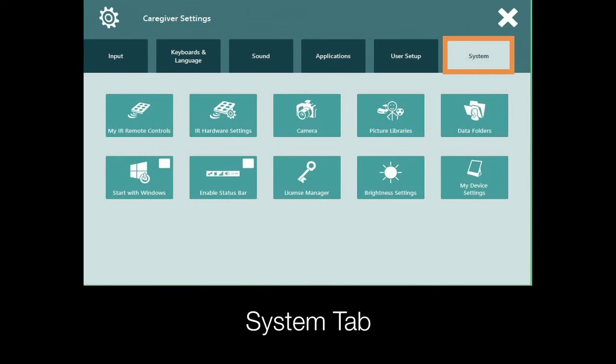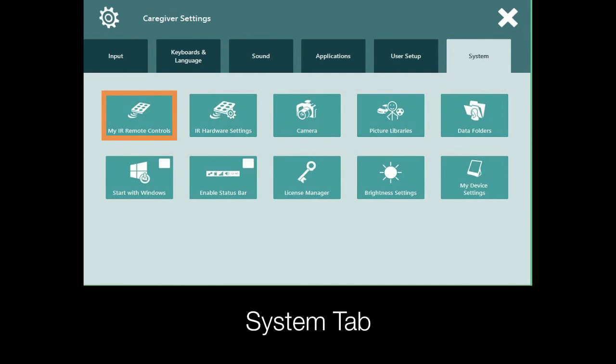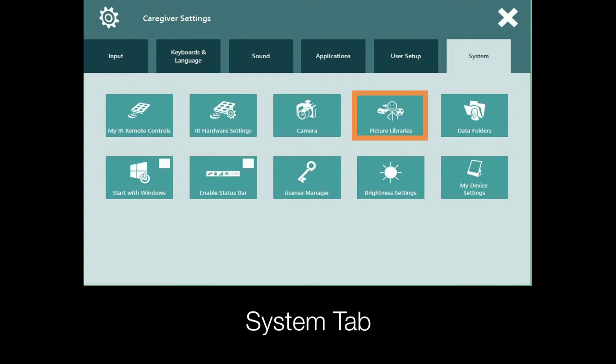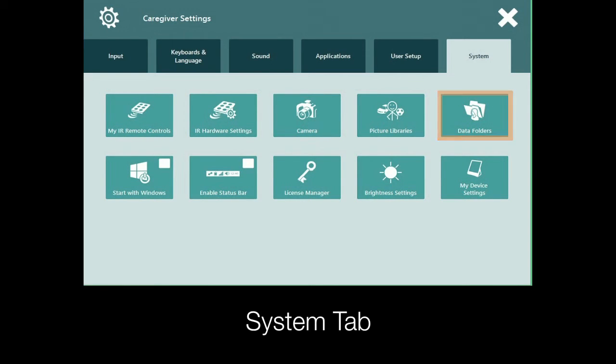The System tab offers a collection of settings that allow you to manage things such as IR remote controls, the camera, photo libraries, the visibility of the status bar, and data.